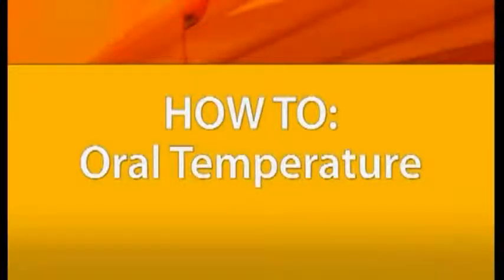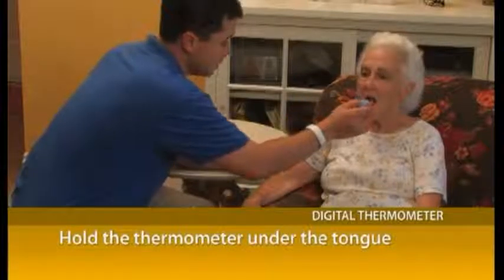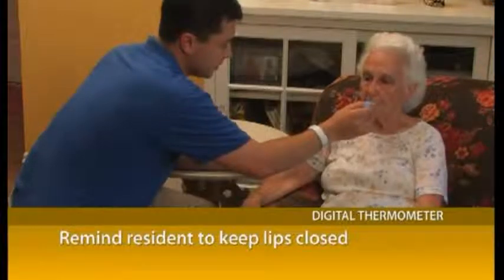There should not be anything hot or cold in the resident's mouth for 10 minutes before taking the temperature. It's important to always use the manufacturer's recommended probe covers. That way we do not spread infection within our community. Ask the resident to open his mouth, put the covered tip under the tongue. Ask the resident to close their lips gently around the thermometer.